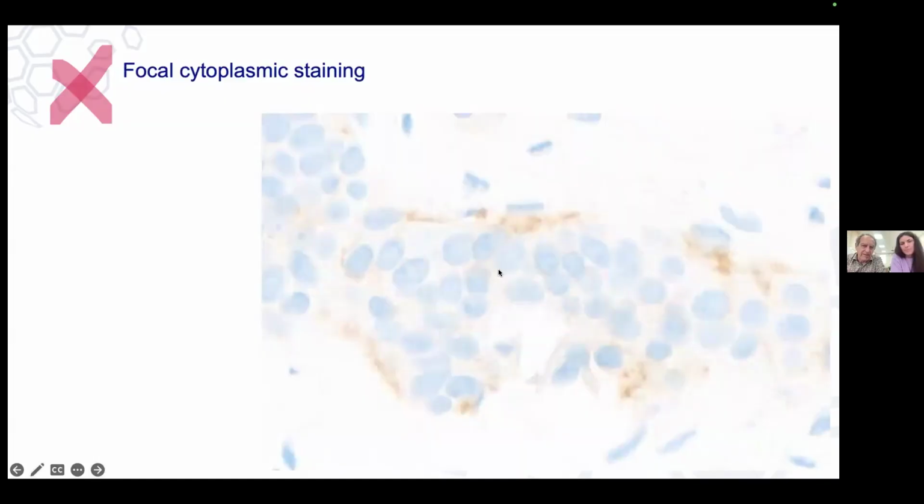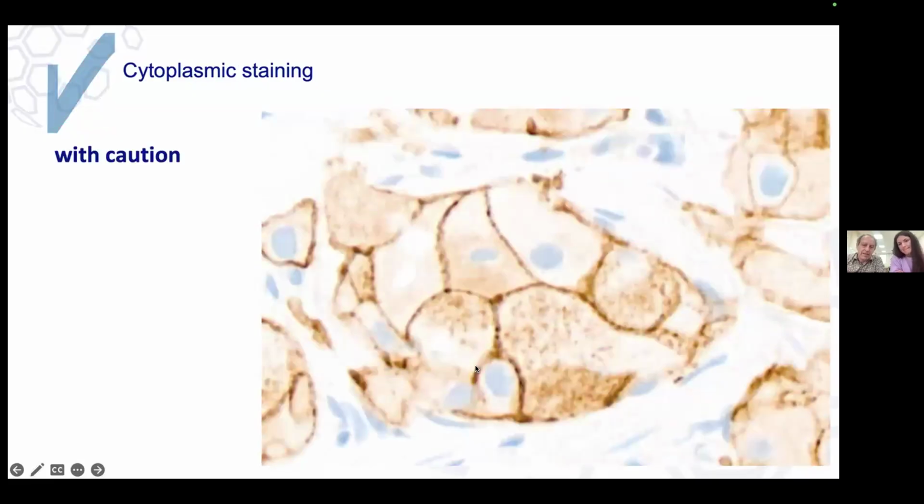Okay, so cytoplasmic staining, and then it can be focal. And here you see how this looks like a macrophage, or we are staining the cytoplasm of a macrophage. There is something not right, but it is certainly not in the membrane. It's fuzzy. This may be membrane staining here. That could be a combination. But this would be the difference between an ultra low and a low. For instance. Okay. And sometimes we see this very strong granular cytoplasm membrane staining together with cytoplasmic staining.